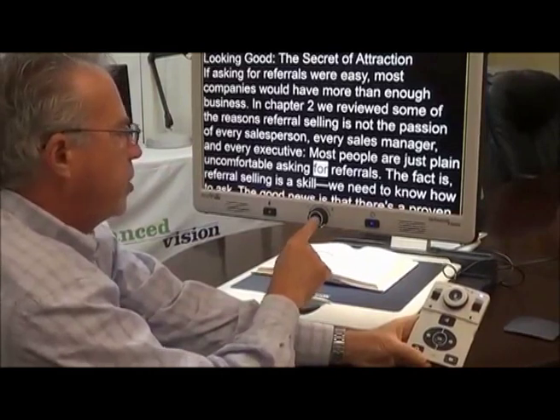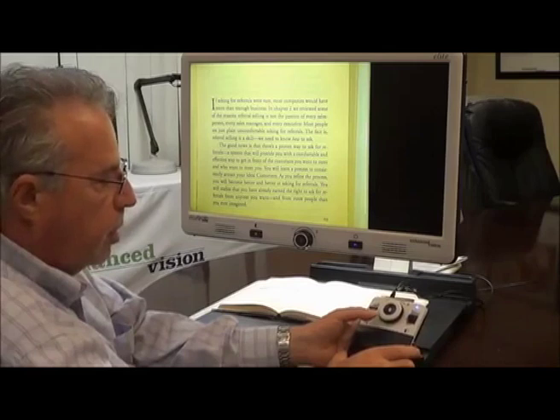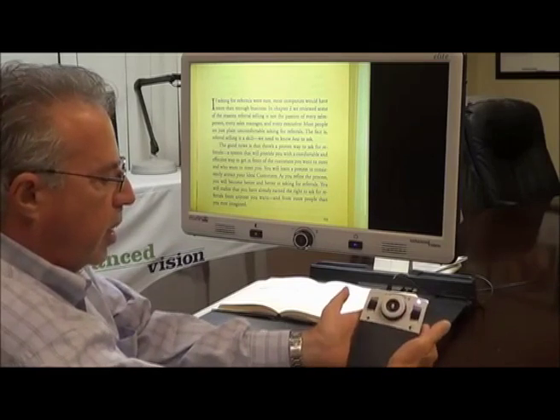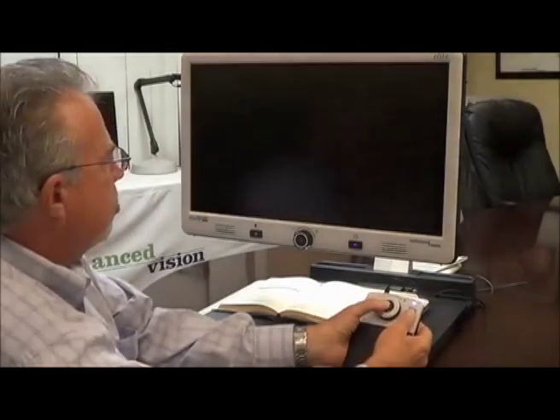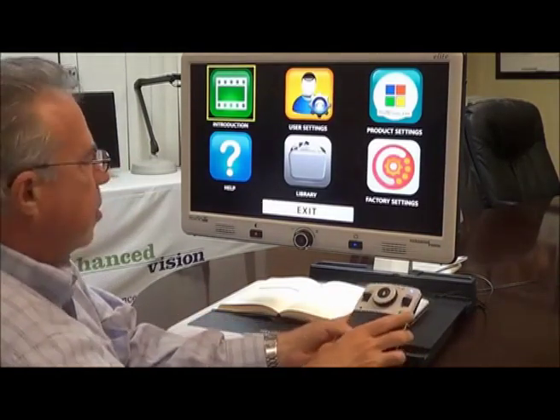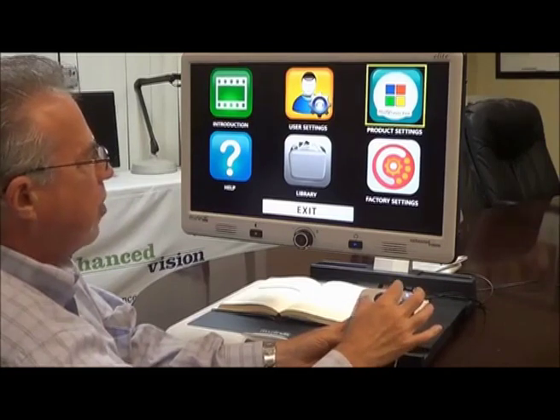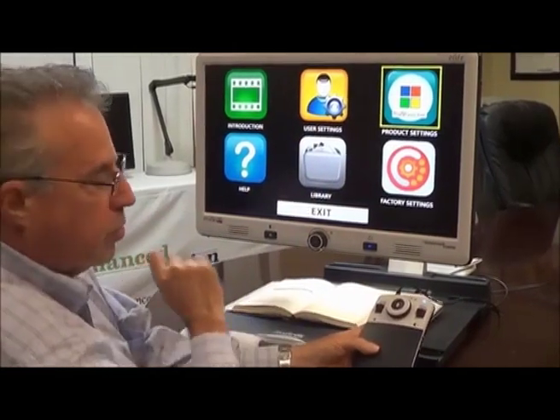Remember, at any time I can switch back to live mode if I wish to do that. Earlier I mentioned the menu — let me show you how to access that. Take the controller, press these two buttons in sequence, and it gives you access to the menu. Using the scroll wheel, I can move to the various choices within the menu.